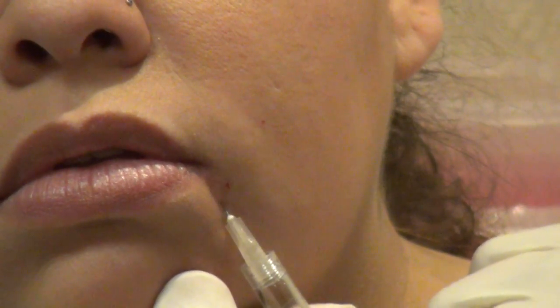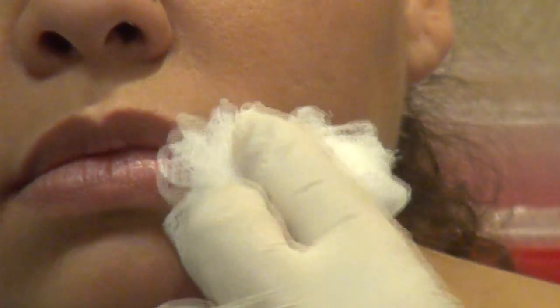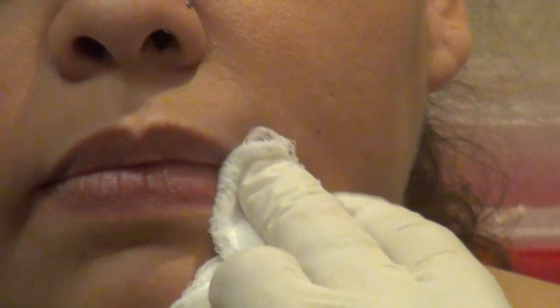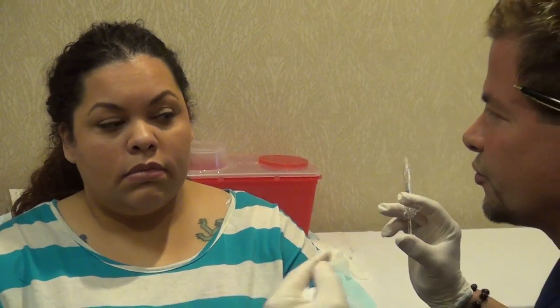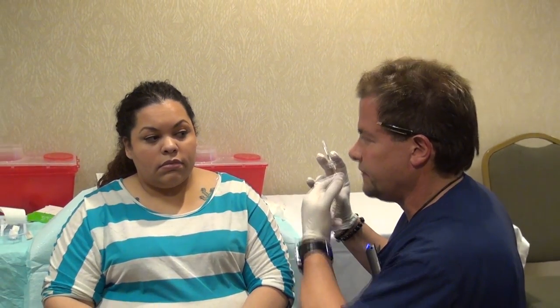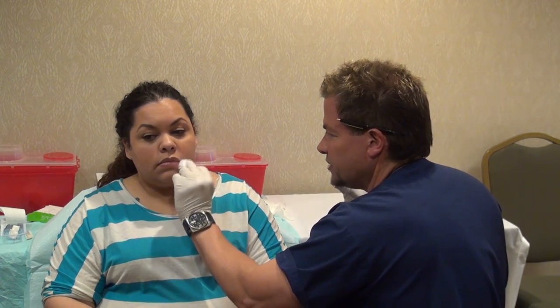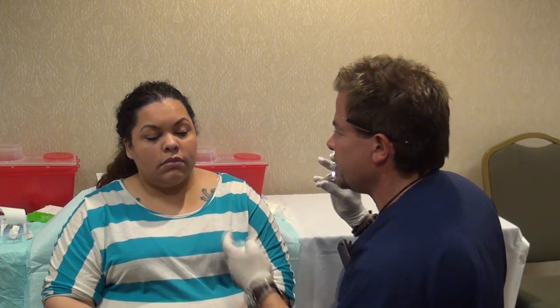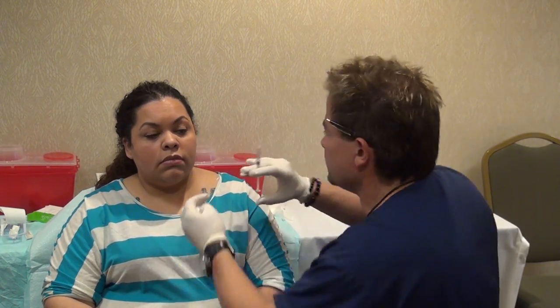You're also watching the plunger to see how much product is coming out and how fast. When people ask about dosage — it's visual. It's not '0.2 cc's or three milligrams' — it's what you see. That's coming out nicely. Remember: this is a very hydrophilic product, so you'll feel it for a couple of weeks. Eventually you won't feel it and you'll think the product is gone, but it's actually been replaced with water molecules — that's how this works. The filling effect is mainly from the water it draws in.